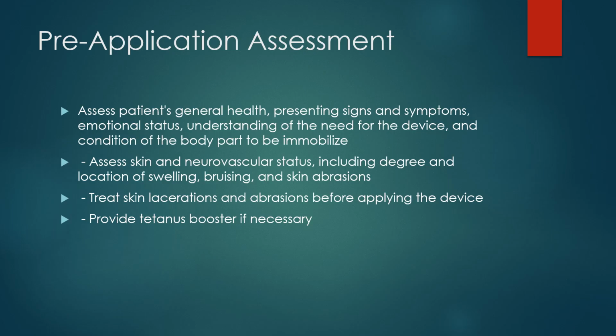So let's look at the pre-application assessment. What you need to look out for before application of the cast. And this is where we are supposed to take note, because this presentation is technically based on you being oriented to the topic itself, which is immobilization devices. You get a little concept over there. And now the most important part is we are focusing on the examination part, which has to do with cast care and the assessment. So we start with our first point.